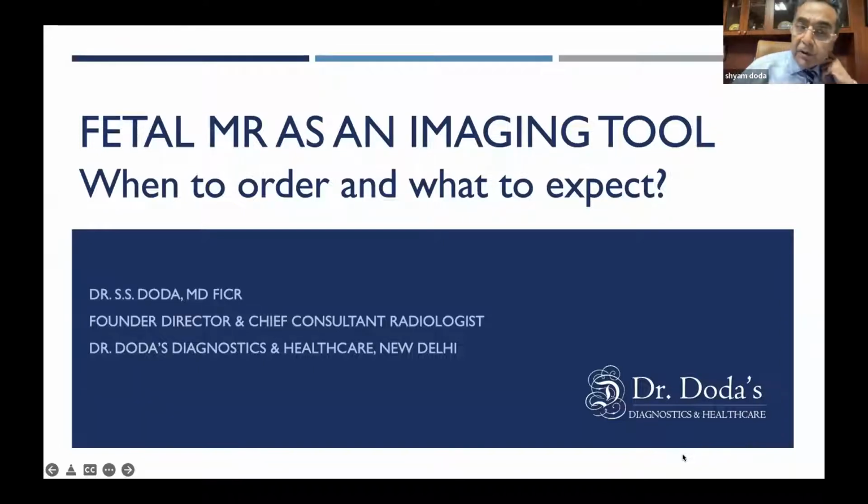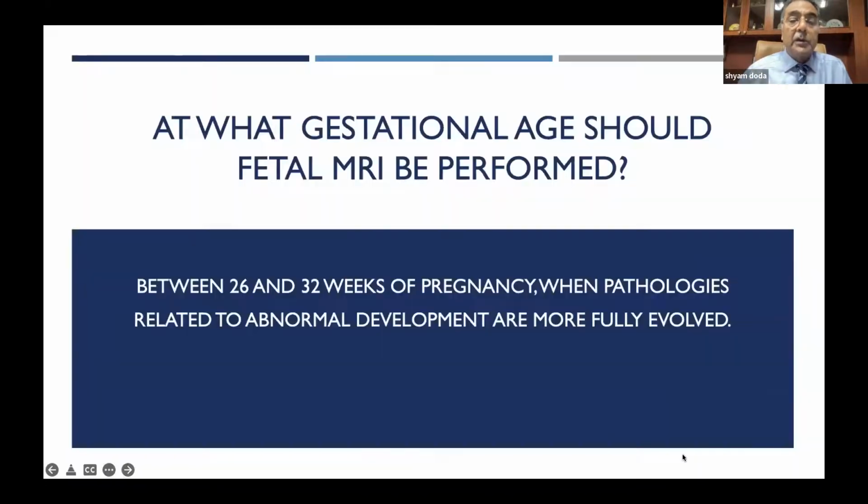Well, I'm going to speak about fetal MRI as an imaging tool. There is absolutely no doubt that fetal MRI is relatively less often used when we are evaluating the fetal anatomy. One of the most important things to know is when to order the fetal MR. And since you have seen such wonderful pictures from Dr. Tina, it seems that probably nothing would be left out of sight as regards the details of the fetal anatomy, and especially the brain and spine.